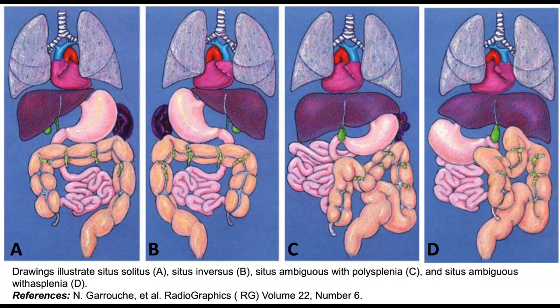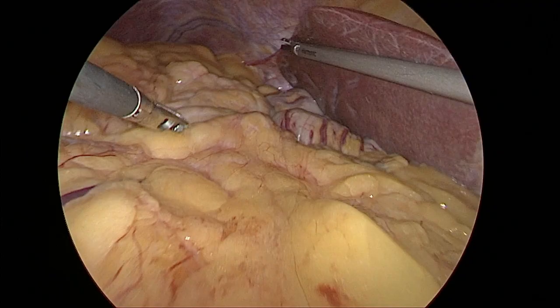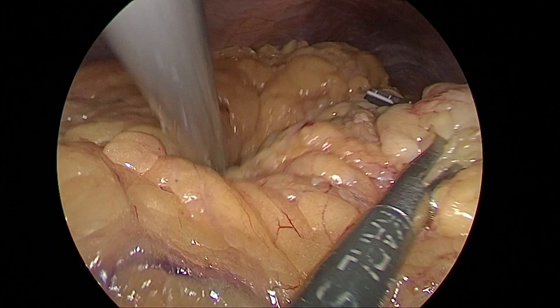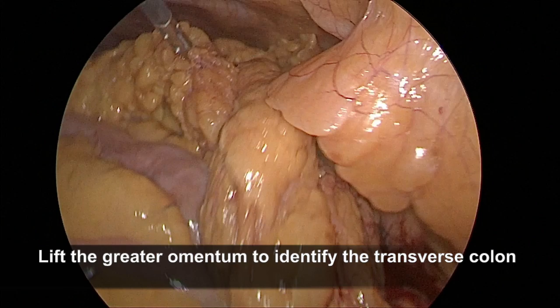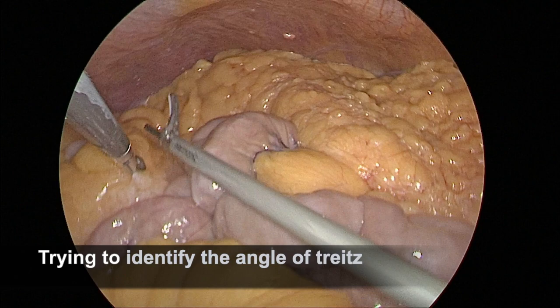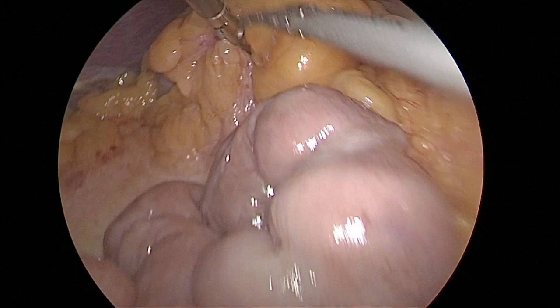Situs inversus is associated with other anatomical variations known as visceral heterotaxia, as demonstrated in the image. Special care should be taken to identify key structures. The greater curvature of the stomach is used as a reference point to locate the greater omentum and the transverse colon, which should be lifted to identify it. Finding the angle of Treitz can be challenging due to possible anatomical variations. The surgeon must raise the transverse colon to more easily identify the angle of Treitz — a key strategy to accurately locate anatomical structures in situs inversus.